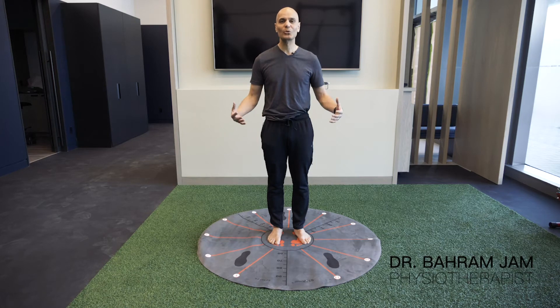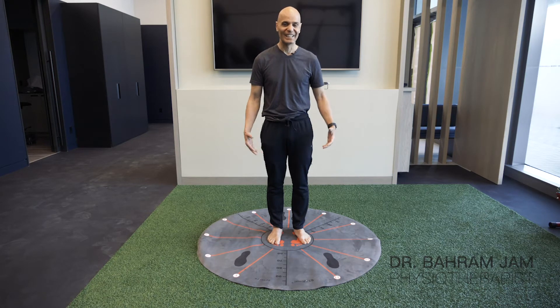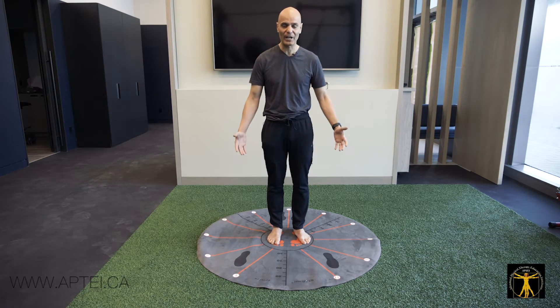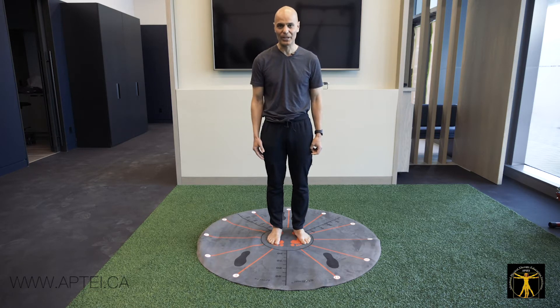The StarMat is one of the most clinically used equipment in the clinic for me. In the past 8 years that it's been distributed across Canada and internationally, I've had extremely positive feedback on it.